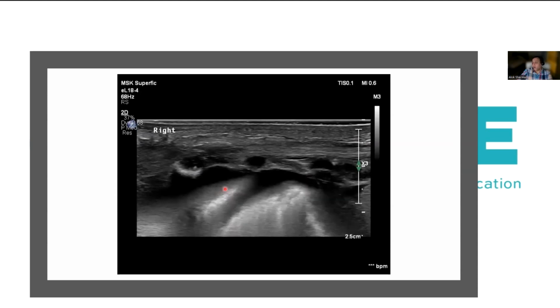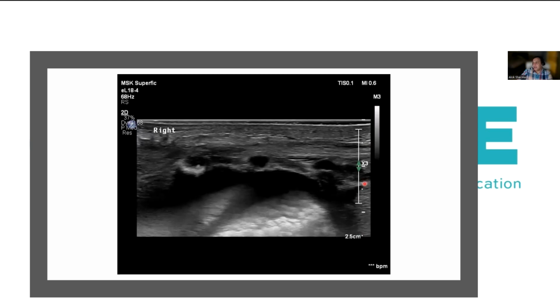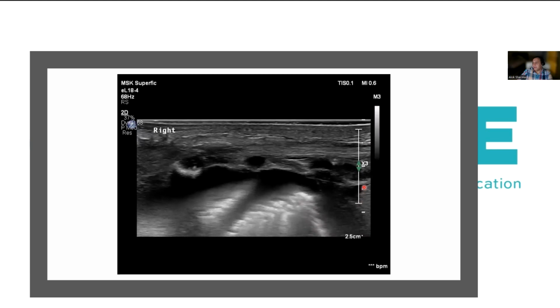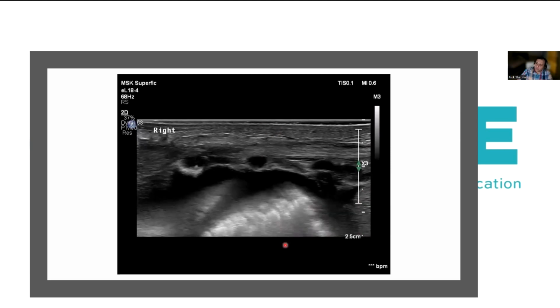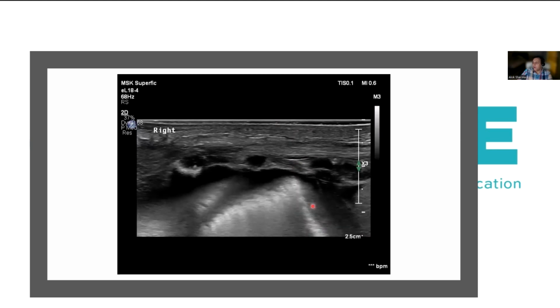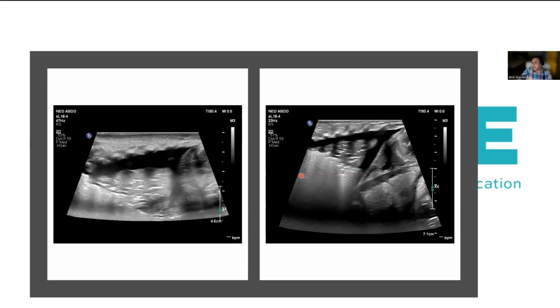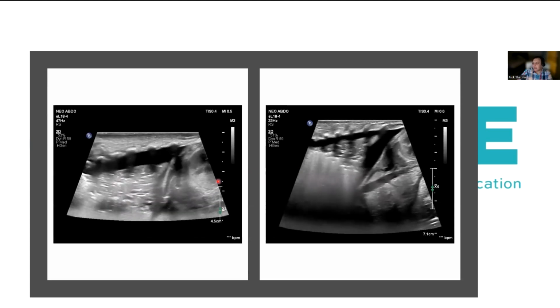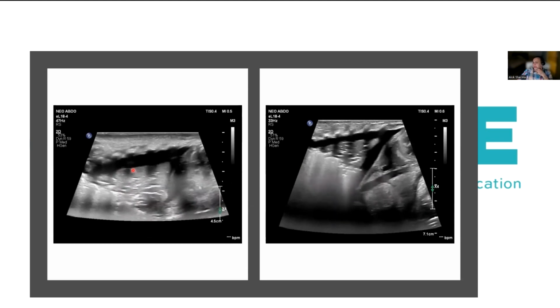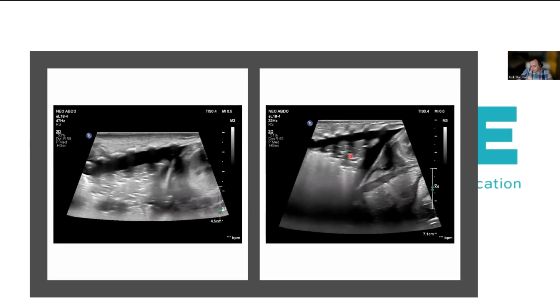As you can see, more than one jellyfish here, with the way there's been compressive atelectasis. You can see an abnormal curtain sign, which is absent because I can define the diaphragmatic margin really nicely. And if I put M mode in this particular region, then really what I would get is a sinusoid sign. So it's quite clear. We've already seen this image. And again, it just gives us an idea about the underlying lung and how it helps with diagnosis.